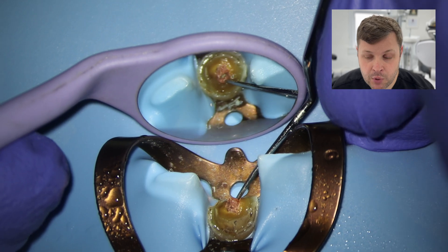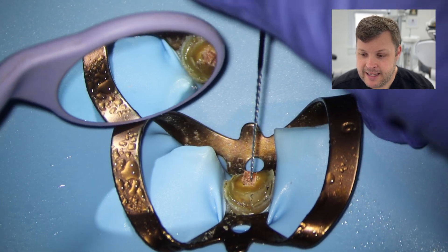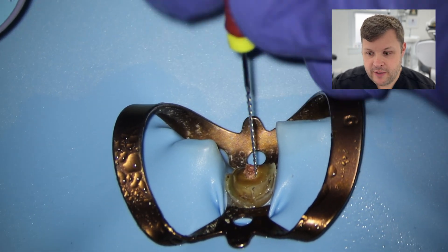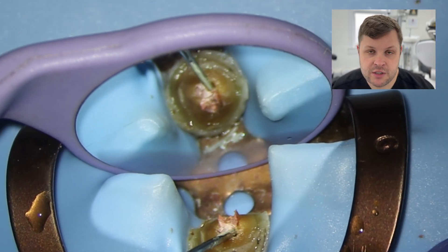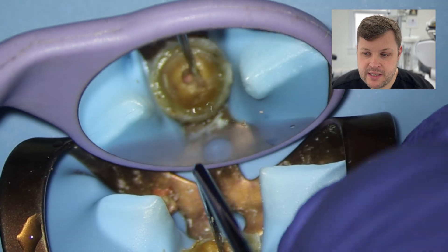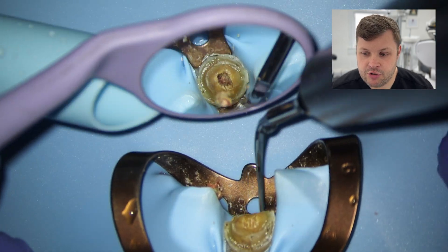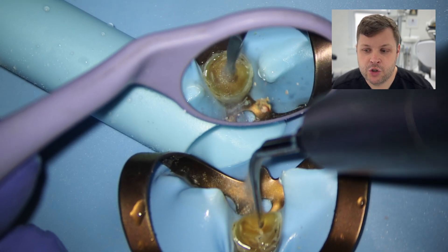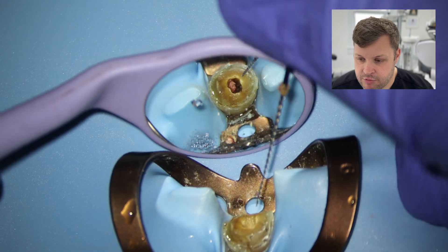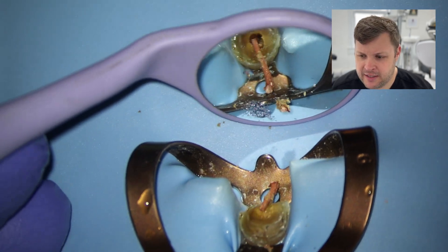I'm going to use a screw-pull technique with an H-file, working it all the way around the GP to try and dislodge it in one piece. I'm using the DG endodontic probe to dislodge it, and it does just dislodge. When we look down the canal we can see there's lots of space and this GP hasn't been compacted very well. I'm going to use a high-energy ultrasonic to drag out as much of the remaining GP as possible — and in fact I just pull it out there with an H-file, which is a lovely feeling.